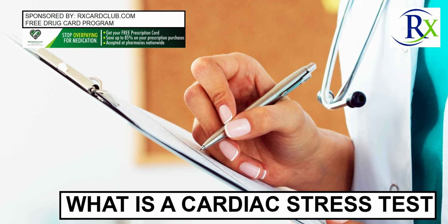How long does a stress test usually take? When scheduling a cardiac stress test, be prepared to set aside no less than 90 minutes of your day. While the test itself takes only about 10 to 20 minutes, it requires preparation and time afterward to cool down. There may also be delays to account for.